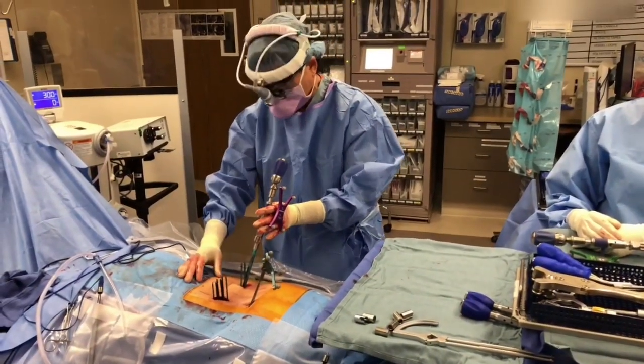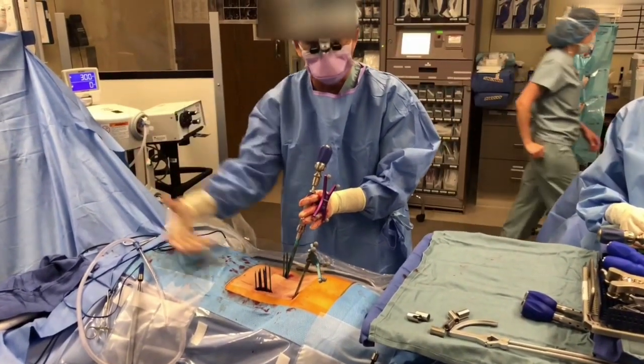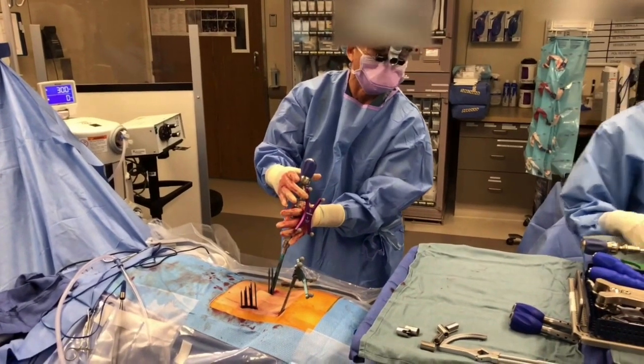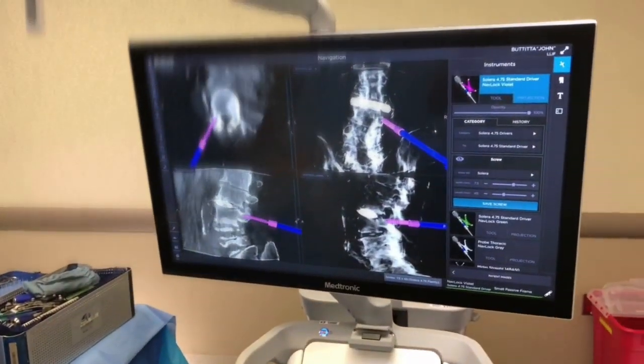We're on the second half of the surgery. I've already put in some screws. You can see that the rod sleeves are sticking out — that'll let me pass the rod without looking all the way down into the wound. This is the navigation driver and I'm putting in the screw very carefully, using navigation to make sure it goes in the right spot. You can see it's going down that tunnel right there.